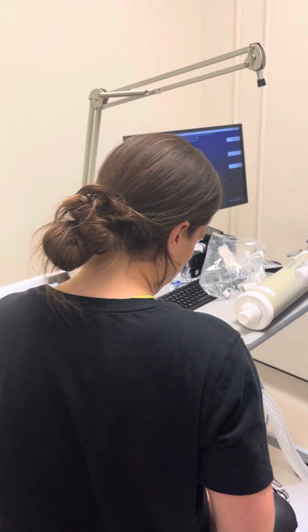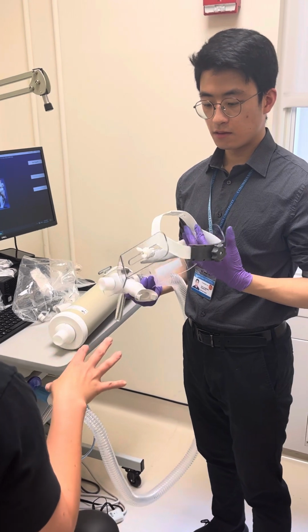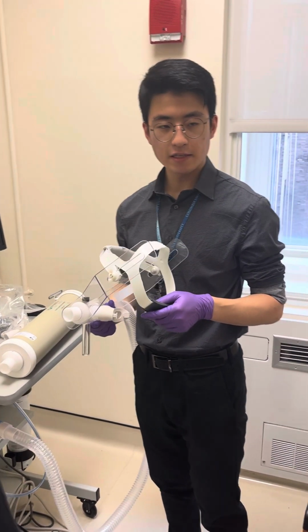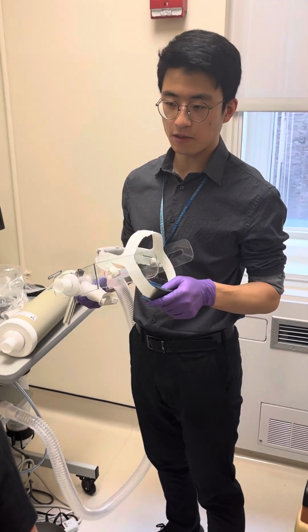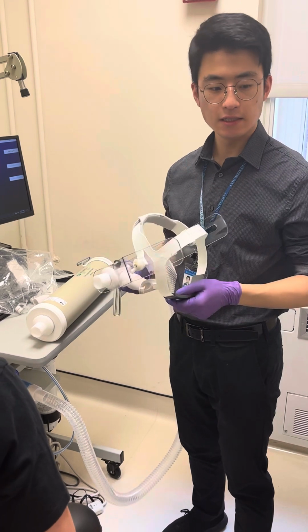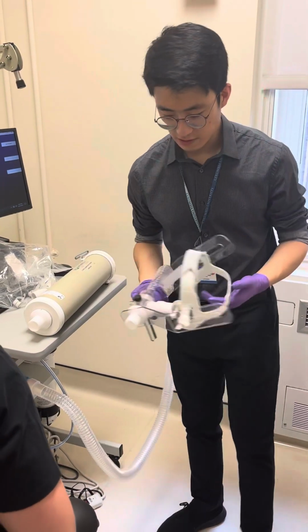Should you have the participant seated on the bike and then place the headgear, or headgear first and then seat? I think it depends. It's up to personal preference. I might have the person sit down so that their head is still. It doesn't really matter. Okay, let's have Katie sit on the bike then.